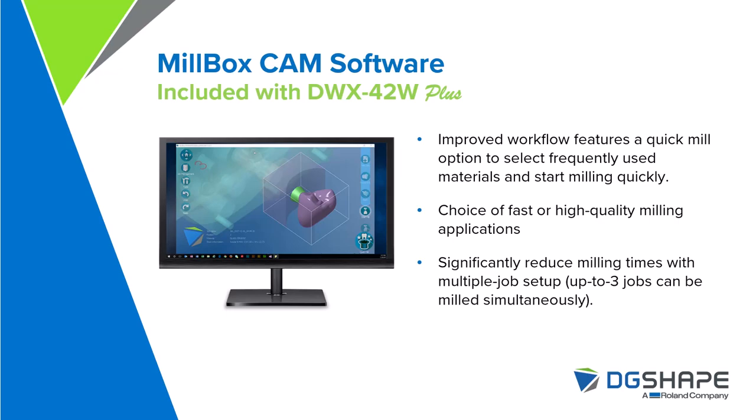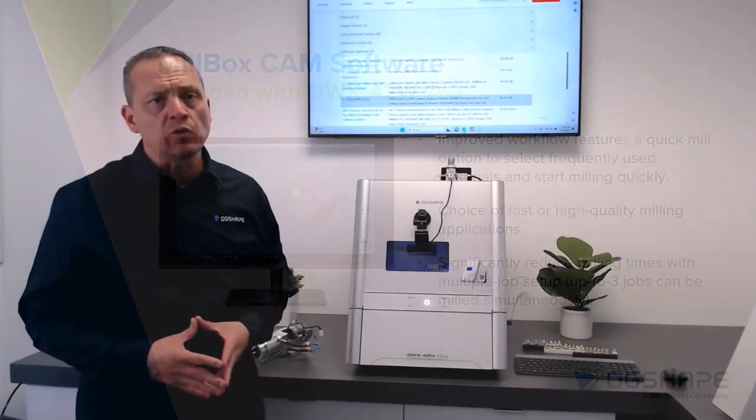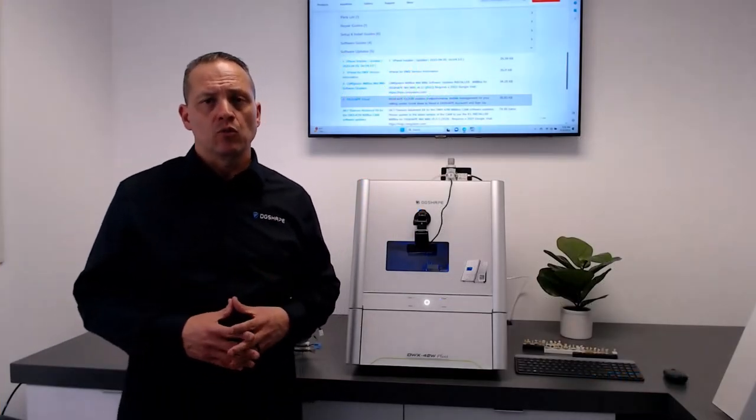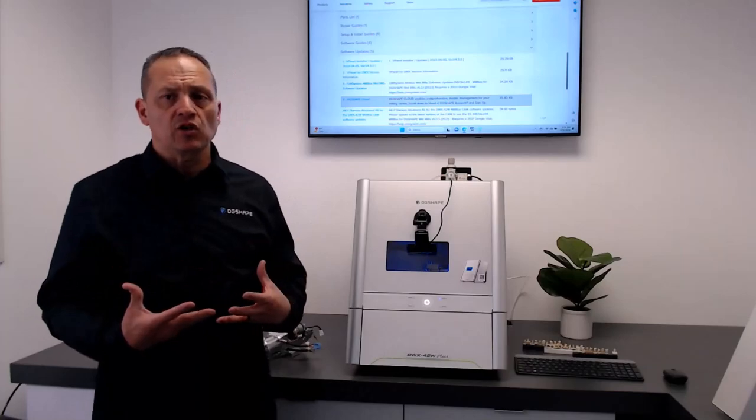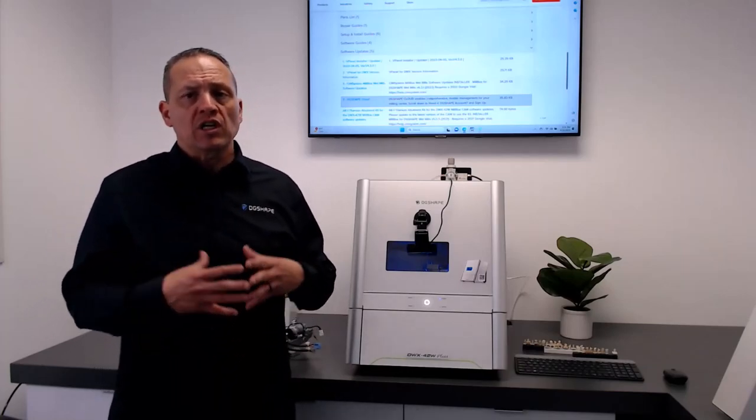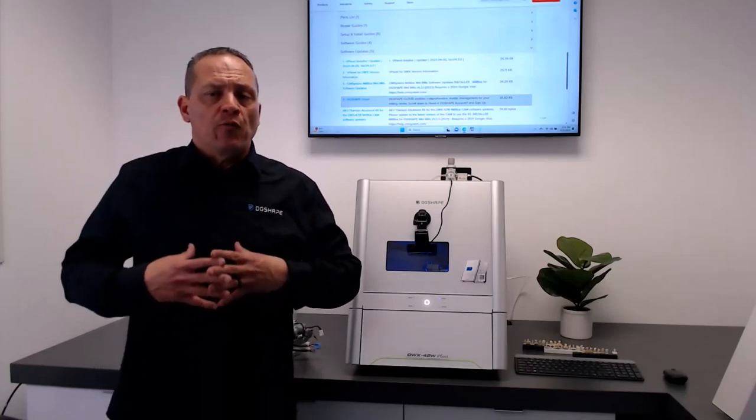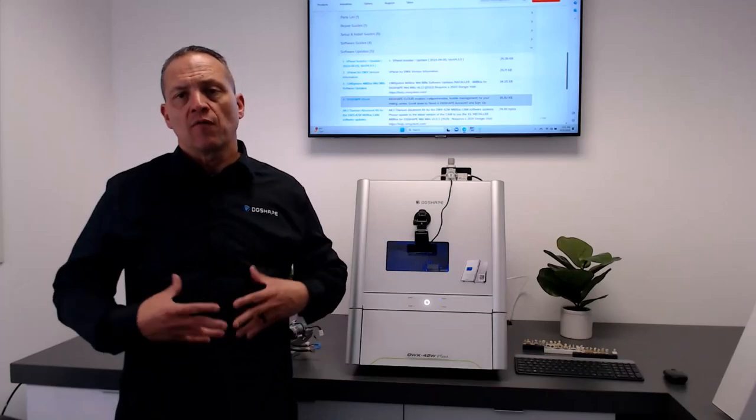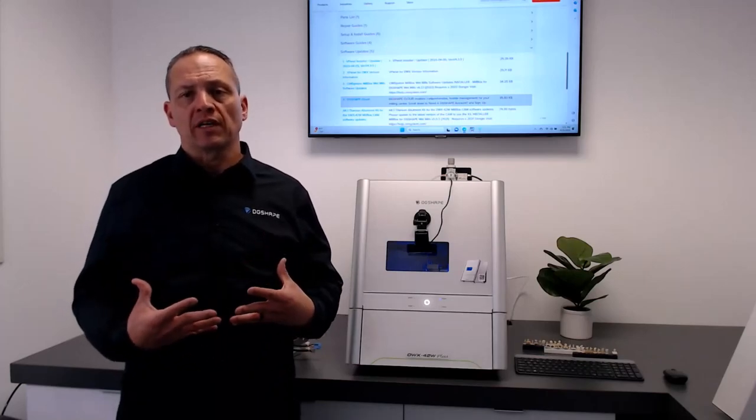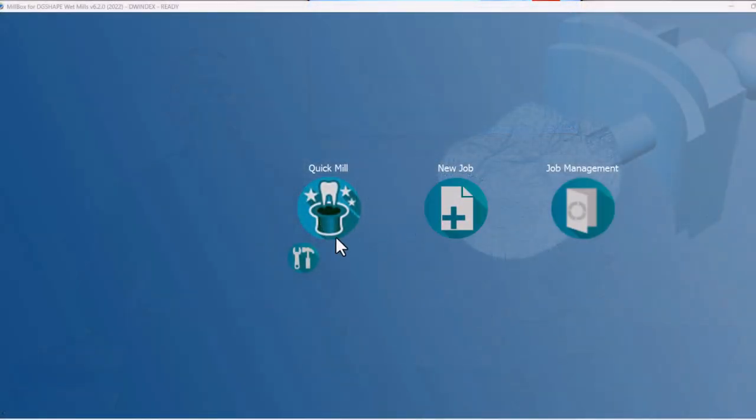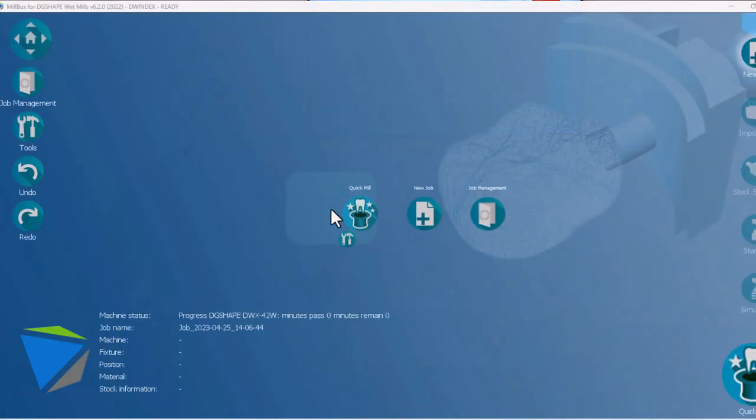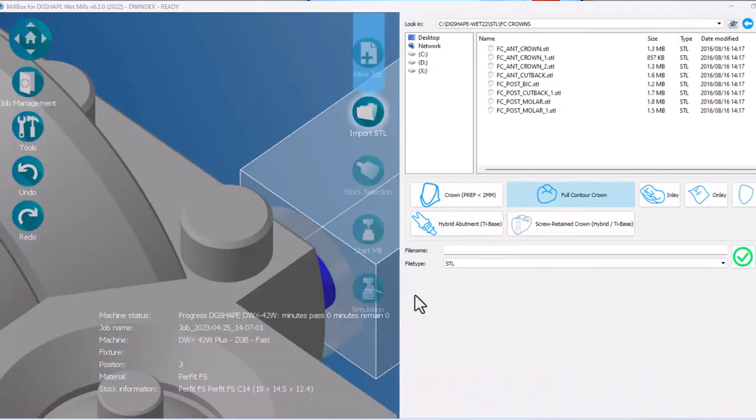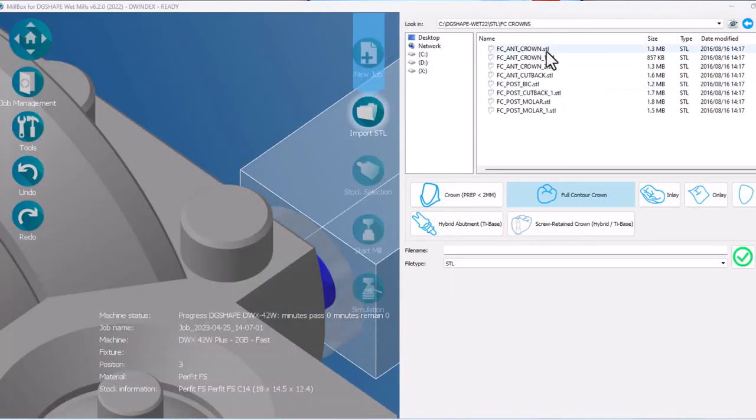The DWX42W Plus comes included with MillBox CAM software, which features an improved workflow, which allows you to set up tools and materials for quick milling. Choice of fast or high-quality milling applications. Significantly reduces milling times with multiple jobs set up.